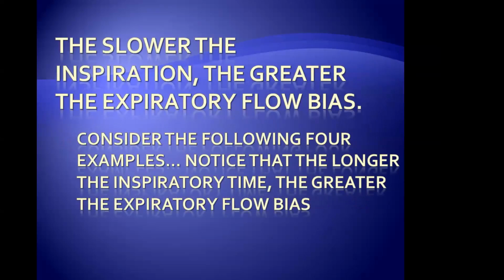All right, the slower the inspiration, the greater the expiratory flow bias. Makes sense. We understand that. So considering the following four examples, notice the longer the inspiratory time, the greater the expiratory flow bias. So again, coach your patient along. Mr. Ms. Smith, slow deep breath in, hold it, and then blast it out. Here we go.